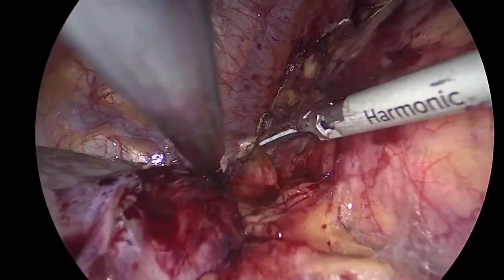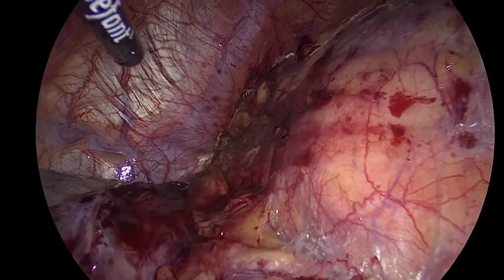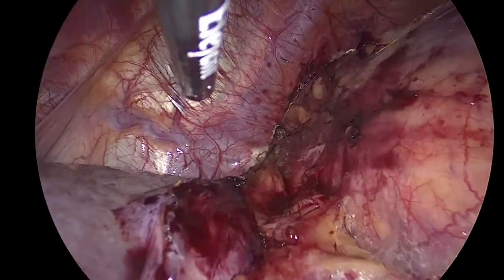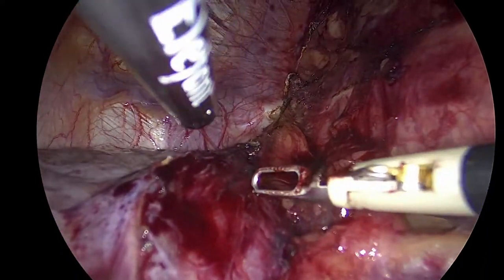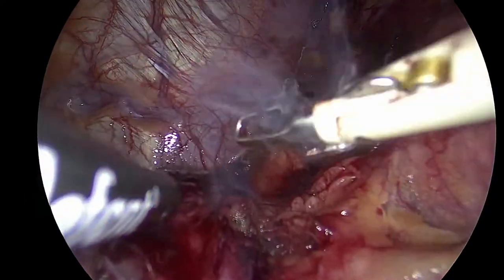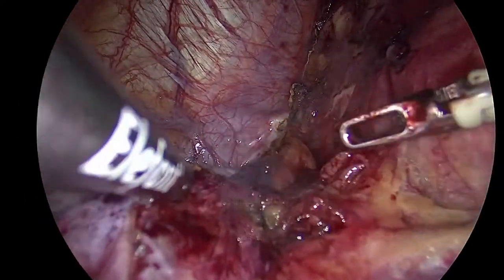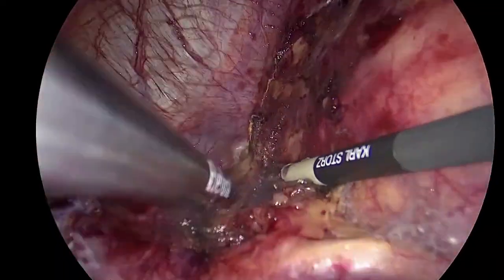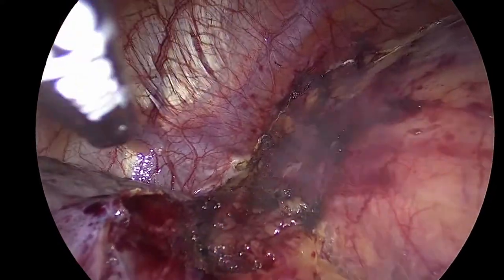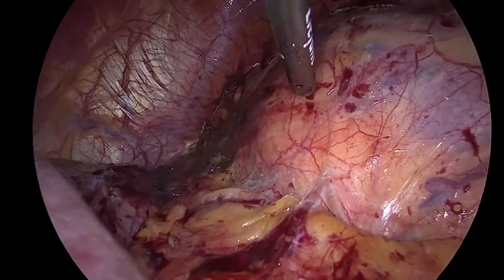Come in. Bipolar. Be always between my instruments. Don't bypass my suction on the side, because if you bypass my suction on the side, I'm fighting with you. Spleen, you deal with everything now. You don't need to deal. Look, it really fell away. It just completely is out of our way. You see this? Completely. Give me higher harmonic.